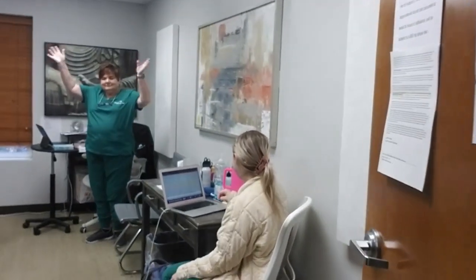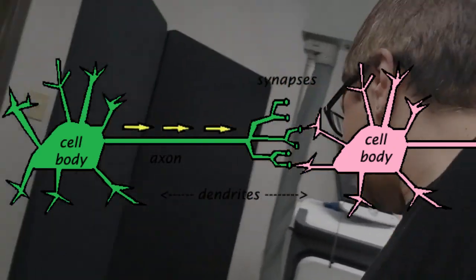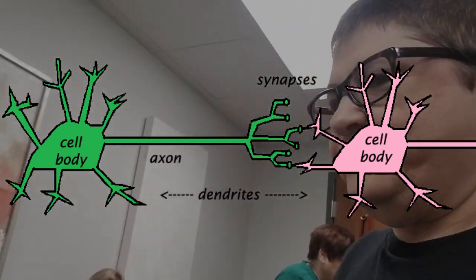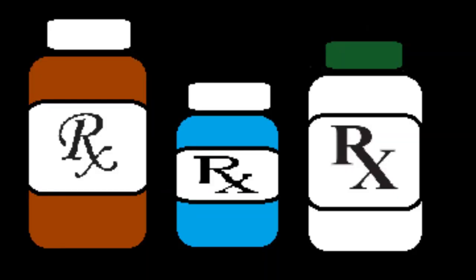Transcranial magnetic stimulation, or TMS therapy, is a non-invasive in-office procedure that uses magnetic pulses that cause the neuronal axons to become electrically excited and trigger action potentials, releasing neurotransmitters into the postsynaptic neurons. It is thought that this mechanism activates neural pathways that are inhibited during depression and other mental health conditions, and by doing so, improves symptoms. This treatment tends to be used after patients fail trials of several medications.